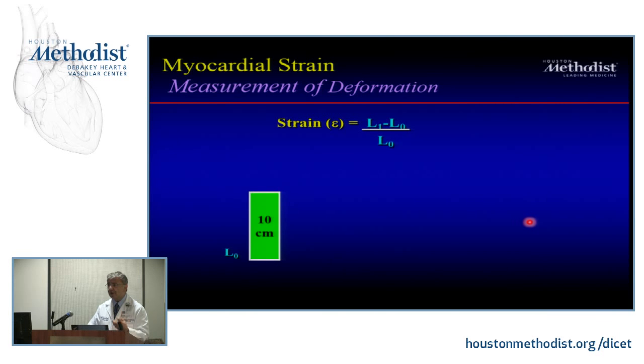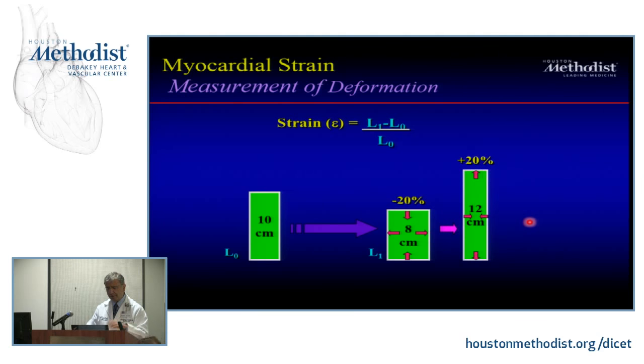What is strain? It's deformation. Now, don't get hung up only on global longitudinal strain. This is one part of the vector. All deformation is, if I have a piece of muscle that is either stretched or compressed, it is stretched and compressed in multiple angulations, not only in the longitudinal vector. So you can't forget about that. So strain is a deformation, right? If I have shrinking of it, its percentage is almost like thickening, if you will, in one of the vectors.